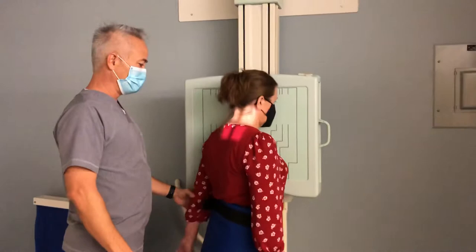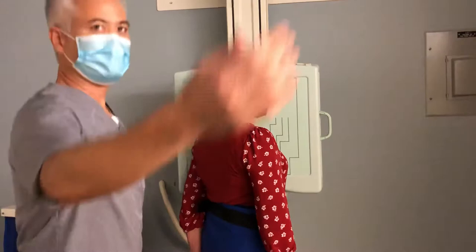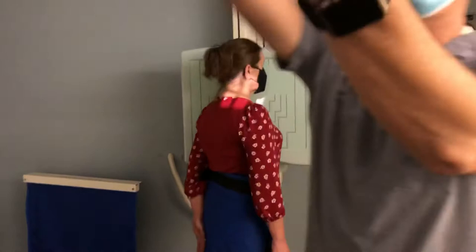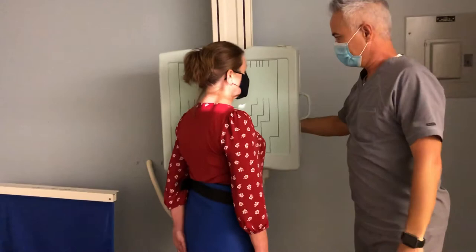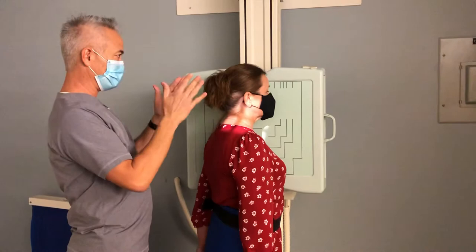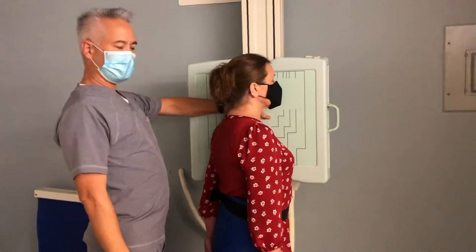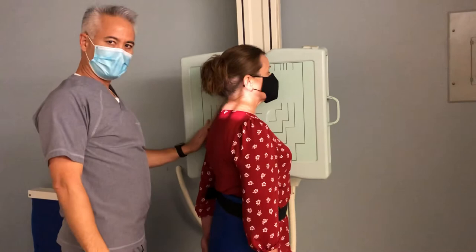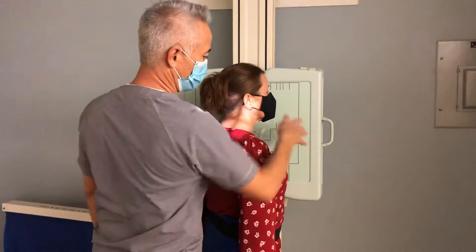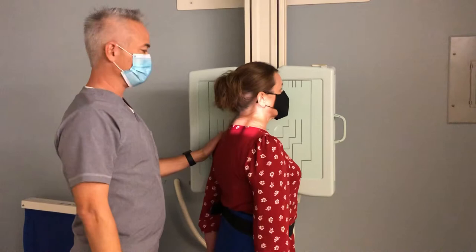Turn the left side a little bit and bring the left hand slightly back so you can move the bucky up and down without them getting stuck, but they still have something to push against so they're not wobbling. Raise it up just a tiny bit to cover the EAM. Make sure her feet are apart a little bit. She's standing 45 degrees to the bucky — she'll be staring at the corner of the room. You'll see a little bit of light in front of her neck and behind her on your marker. This is her left side, so the left marker goes on this side. Because we're looking at the left foramina, we use the left marker to indicate the area of interest and side correction.